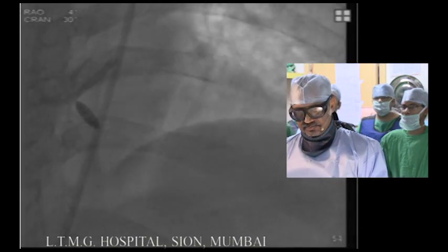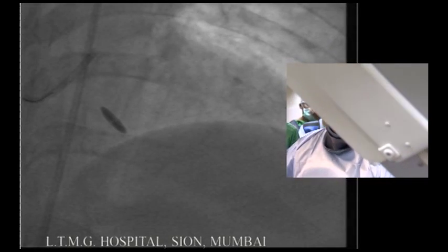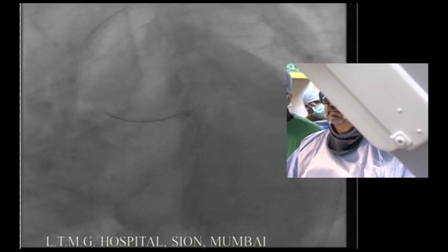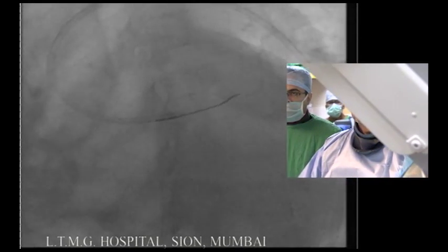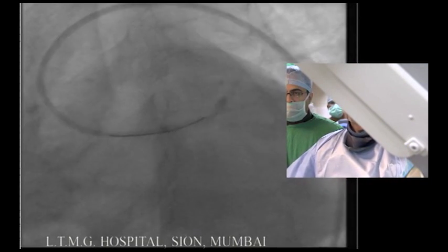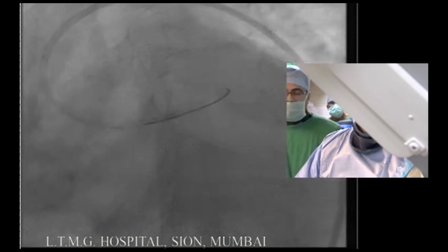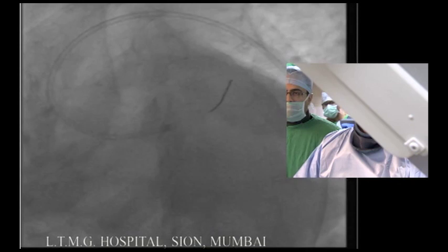I will pass it on to my colleagues. What do they think? Andrea Rognoni from Italy. I completely agree with my colleague. I think that predilation and an imaging test are mandatory in this case.